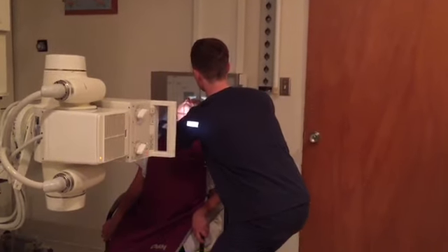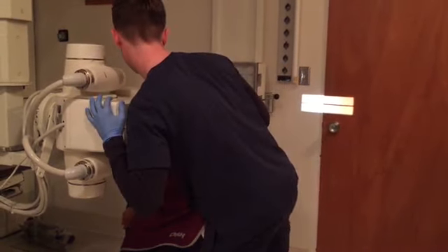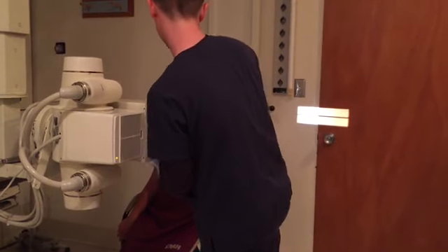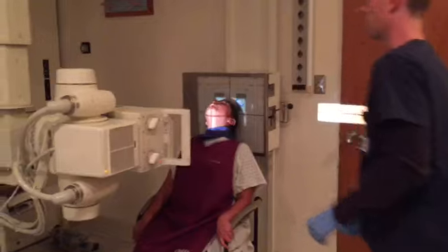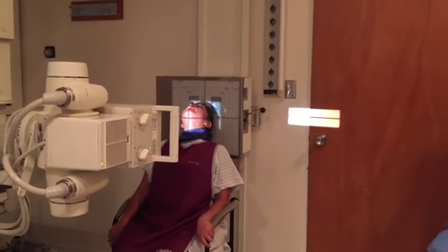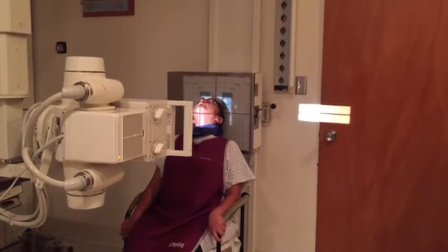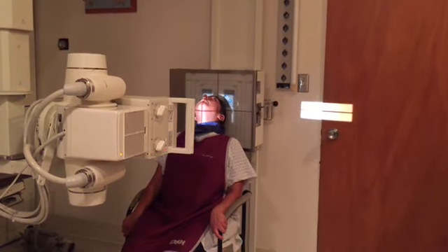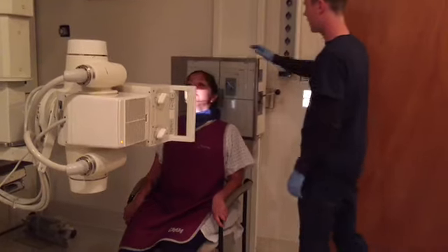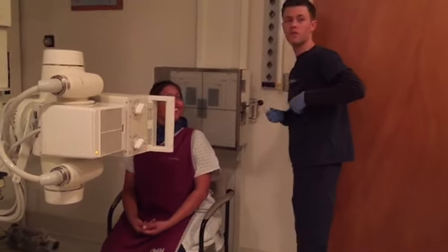Just rotate your head a little bit this way. Perfect. Right there. Collimate it down. Okay, for this one again, about 70 to 75 kV at about 8 to 10 mAs. Alright, Evelyn, go ahead and hold your breath, don't move. Expose. Alright, go ahead and breathe, you can relax. How are you feeling? Wonderful. Alright, great.